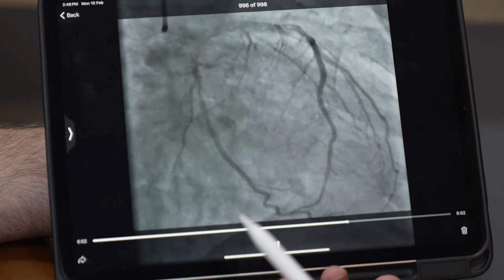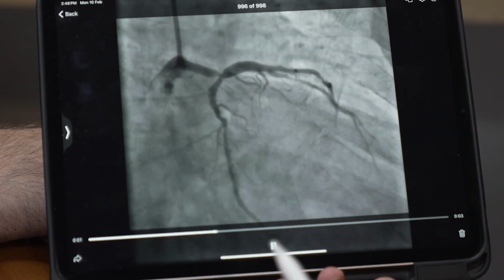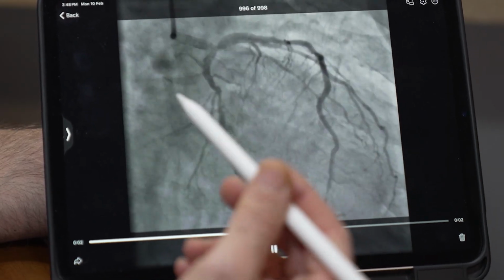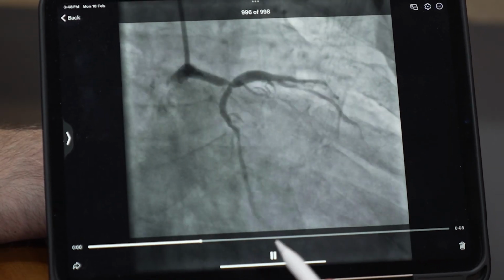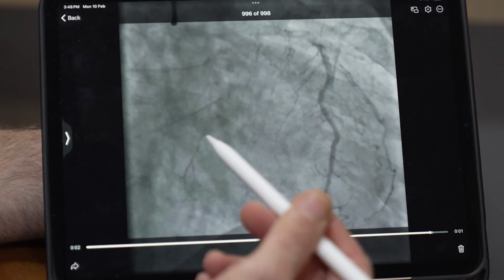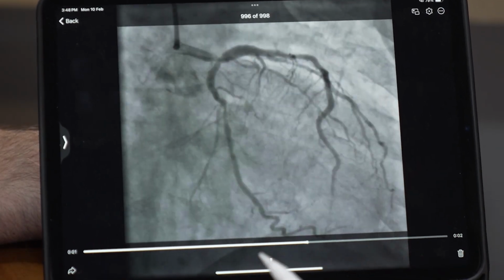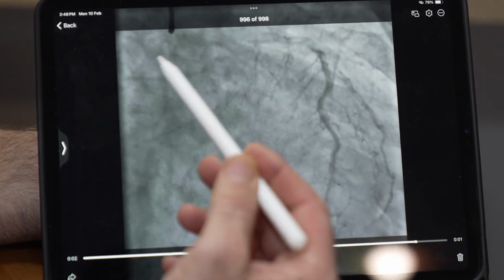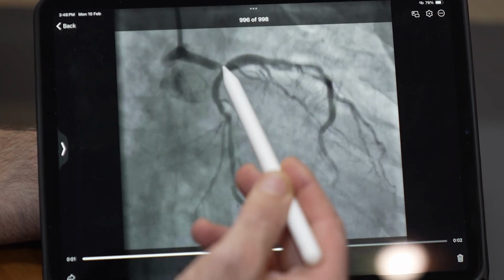It is a large one. Large one, and we are going to maybe 5. We depend on the IVUS imaging. And it's very important for such lesion, and in every left main stem, to go for intravascular imaging. And that's what we are going to do to assess the size of the distal and the left main stem.